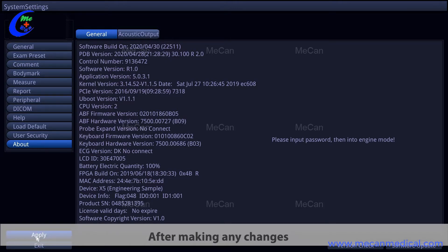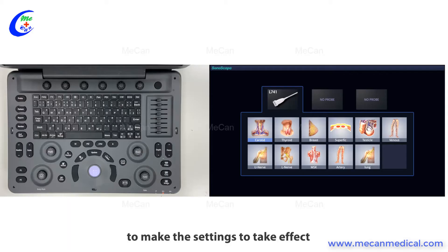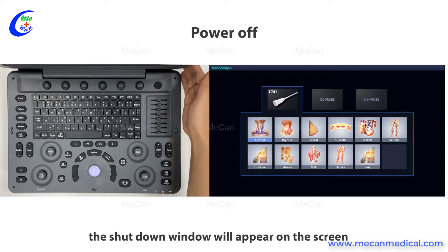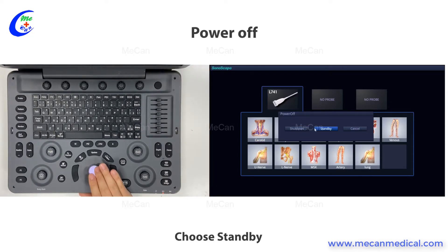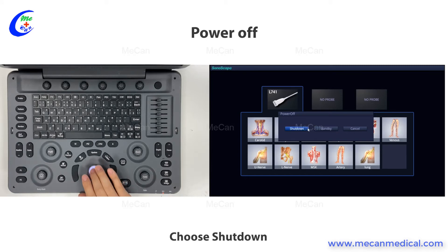After making any changes, pressing the apply button is necessary for the settings to take effect. Press the power button and the shutdown window will appear on the screen. Choose standby — the device will go to standby mode and boot up in several seconds the next time you press the power button. Choose shutdown to shut down immediately. Cancel is used to cancel the shutdown procedure.